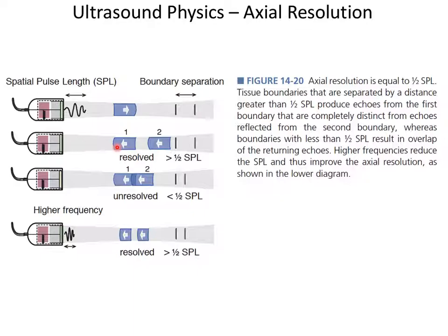In ultrasound imaging, you saw the detail through that object, right? So we go ping, bing, bing, bing, bing, and so on, right? There are many, many echoes that we're listening to as it comes back to create that detailed picture as depth. Okay? But what we're studying here is how close together can two interfaces be, or two surfaces, such that we can still say they're two surfaces. If they get closer than 1/2 of the width or the length of this ping, then we're in trouble, right?